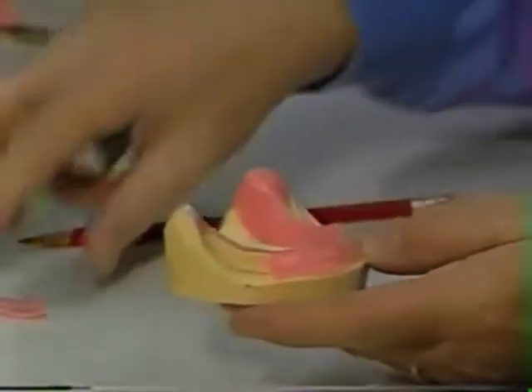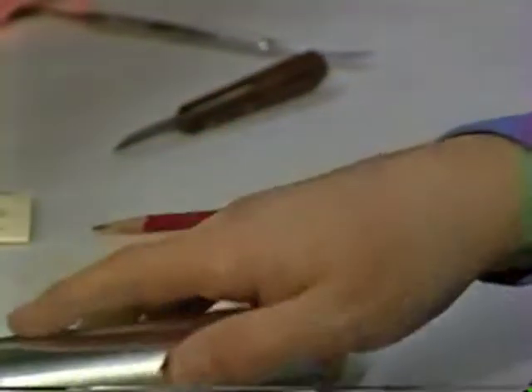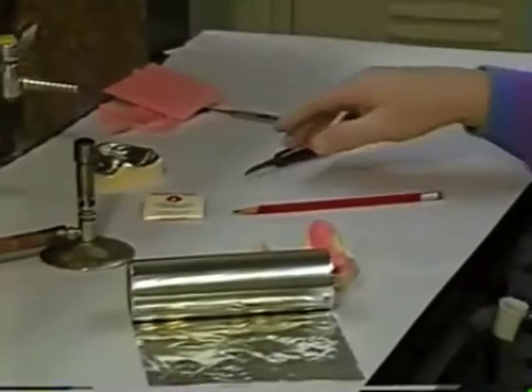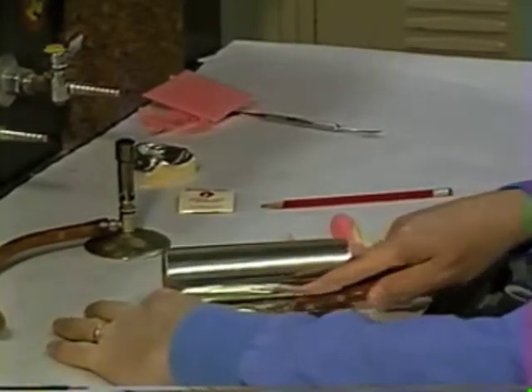So if we've provided stops in it, we're ready to adapt the tinfoil now. And again, it usually takes a little bit more tinfoil to do the lower than it did for the maxillary, so I'll cut just a little bit more off of it.